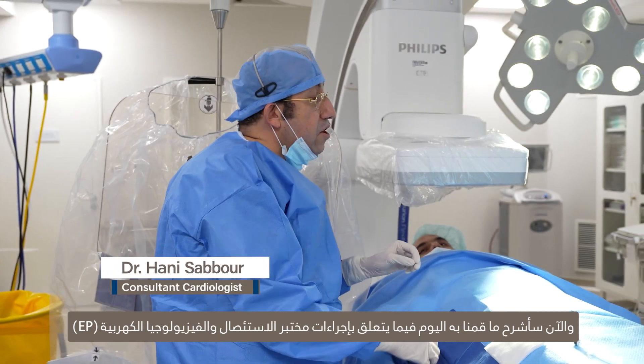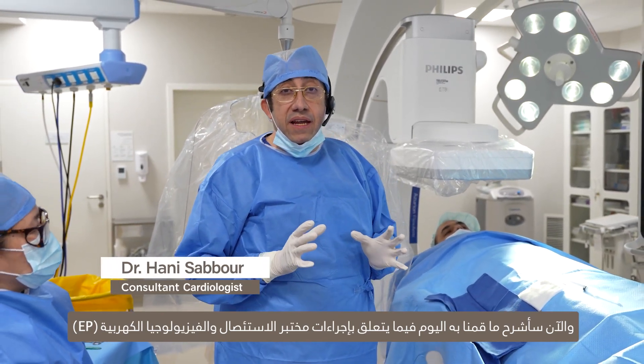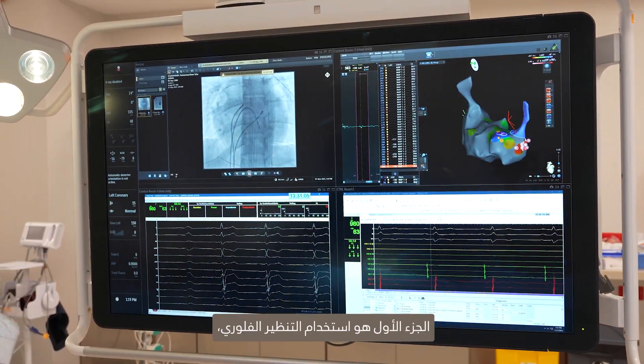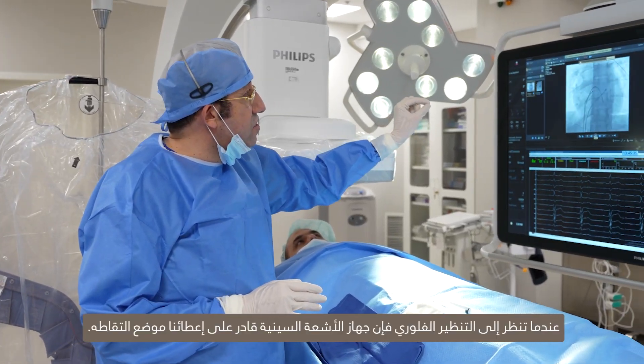I'm going to explain what we have done today in terms of the ablation and EP lab procedure. There are three portions of this procedure. The first one is using the fluoroscopy. When you look at the fluoroscopy, the x-ray machine is able to give us the position of each catheter.